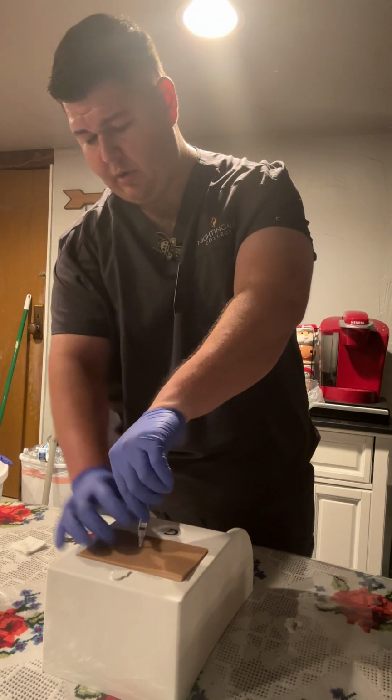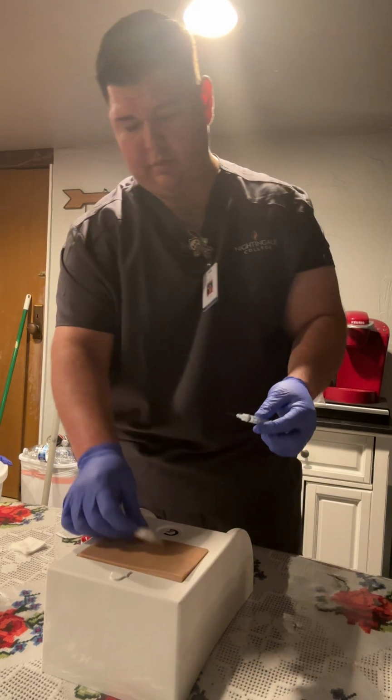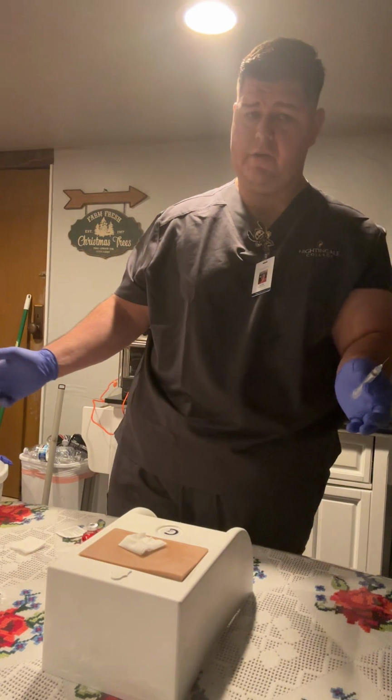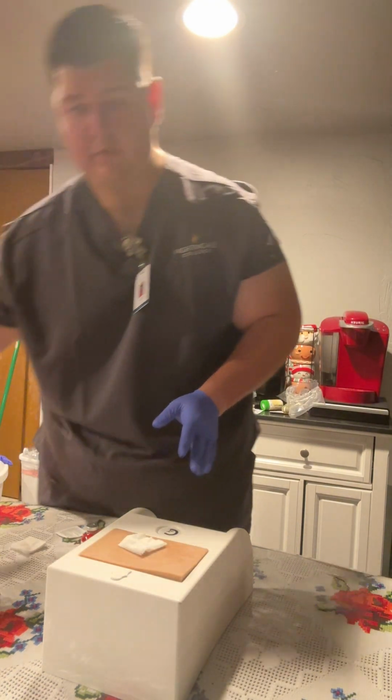All right, here we go. I have my gauze pad. I'm removing the syringe with the needle, and I'm putting my gauze. And I'm quickly disposing of this into my sharps container immediately. So my sharps container, that's good to go.